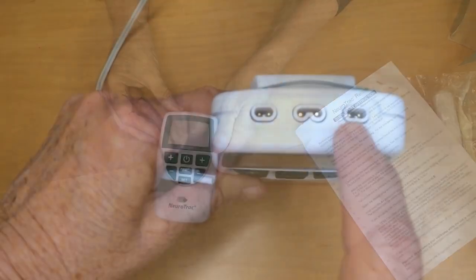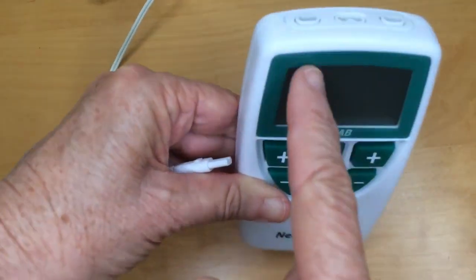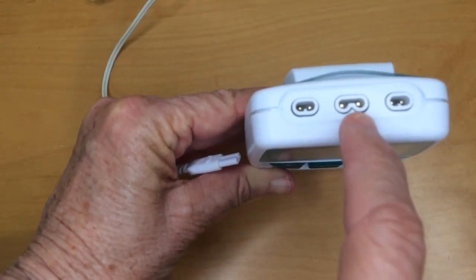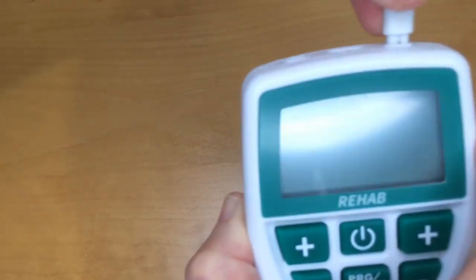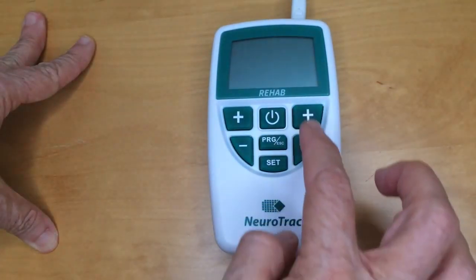There are three ports at the top of the device. There's port A on the right, corresponding to the right buttons, and port B on the left, and the plug for the remote switch in the middle. I always start by plugging a lead into port A to remind myself to use the buttons on the right hand side.